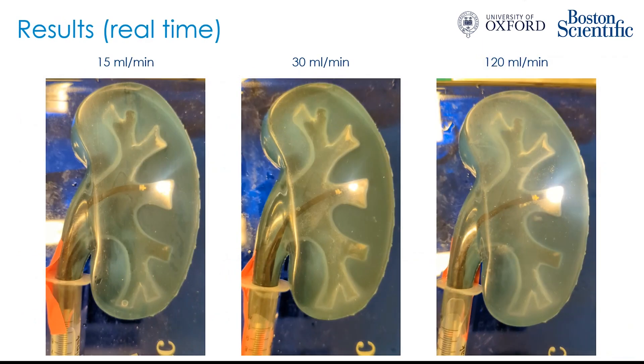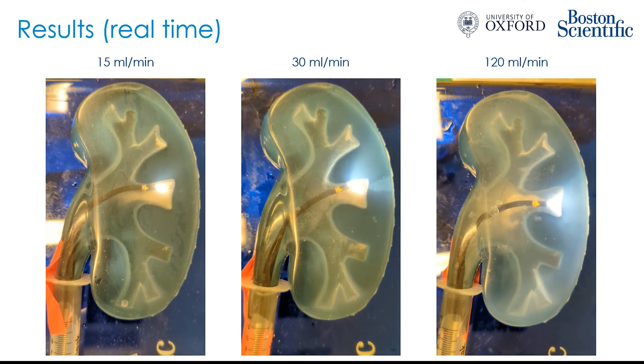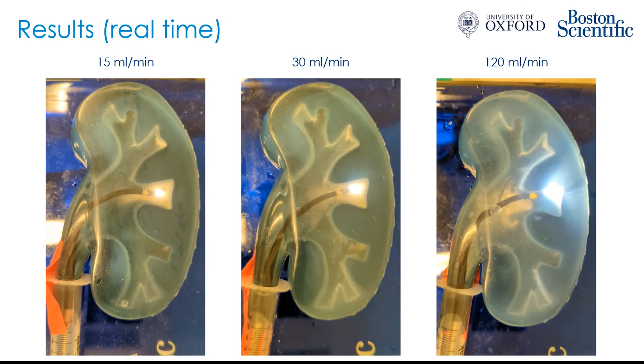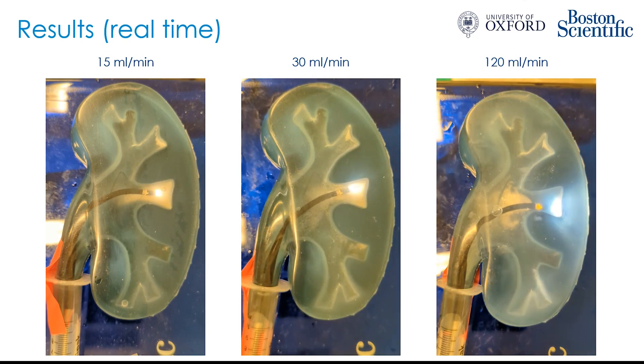Here are some videos to illustrate the effects of irrigation in real time. On the left, the irrigation rate is 15 mils per minute; in the middle, 30 mils per minute; and on the right, 120 mils per minute. You can see that for the lower irrigation rates, the dust appears to respond initially but then appears relatively static, whereas on the right at high irrigation rates, the dust is rapidly moved out of the calyx.